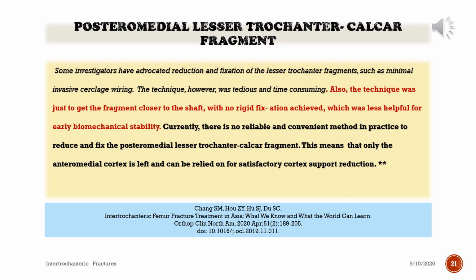Some investigators have advocated reduction and fixation of the lesser trochanteric fragment, such as minimally invasive cerclage wiring. The technique, however, was tedious and time-consuming. Also, the technique was just to get the fragment closer to the shaft, with no rigid fixation achieved, which was less helpful for early biomechanical stability. Currently, there is no reliable and convenient method in practice to reduce and fix the posterior medial lesser trochanteric fragment. This means that only the anterior medial cortex is left and can be relied on for satisfactory cortex support reduction.